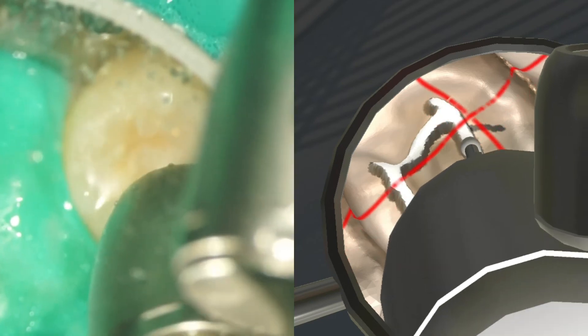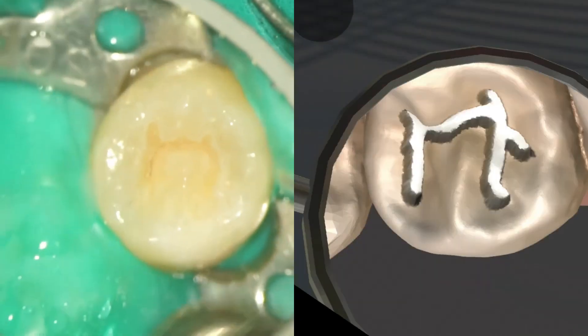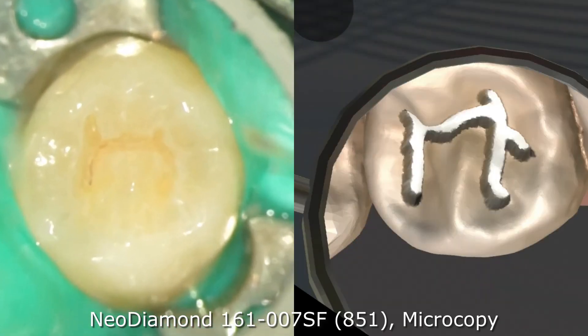The conservative cavity was prepared under indirect vision with the help of magnification. In conclusion, for fissurotomy, I recommend a cone-shaped diamond with a 0.7 mm tip diameter to achieve the required clinical precision.